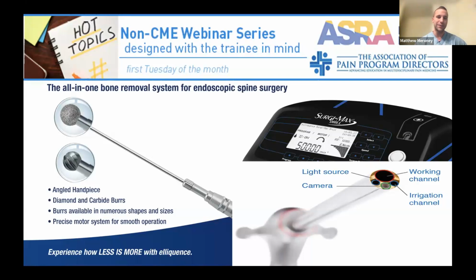There's multiple different sizes, shapes. We most commonly use the 3.7 millimeter burr, but in tight scenarios, if we're using other equipment, sometimes we use different sizes. If you look here to the right, you can look at the main working cannula and the multiple ports. So there's obviously the largest hole or lumen is the working channel, which you can put multiple tools through.